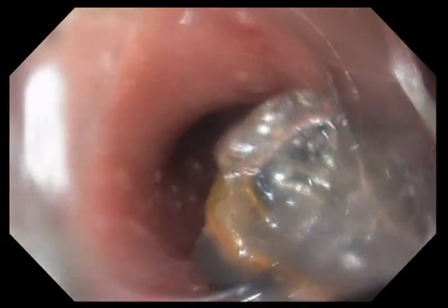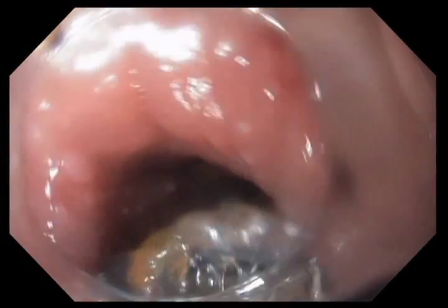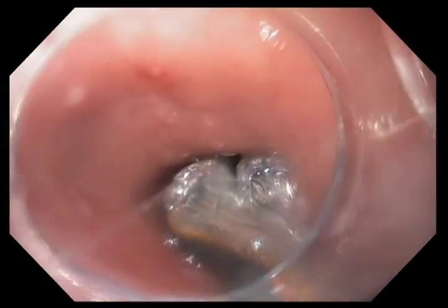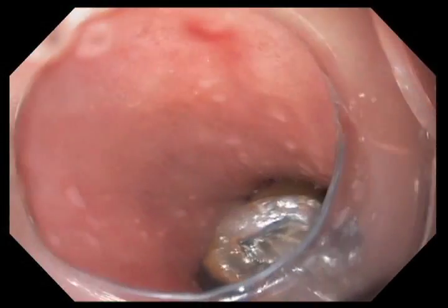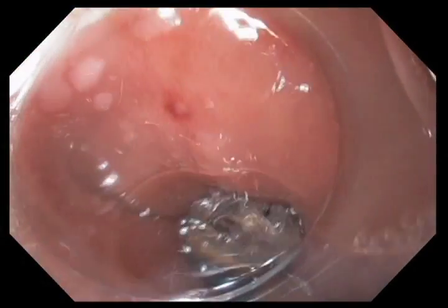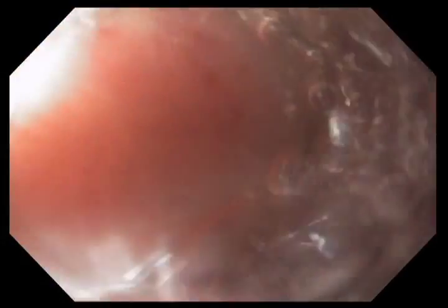We've finished the removal of the coagulum. Once you've treated it once, it's easier to look with white light. We've repassed the clean treatment balloon and are now positioning it in the area where we treated prior. Once we feel comfortable it's in the right position, we'll inflate the balloon, aspirate air, hit the treatment pedal, and recoagulate that epithelium. Once we've treated it twice, we're done with the treatment.